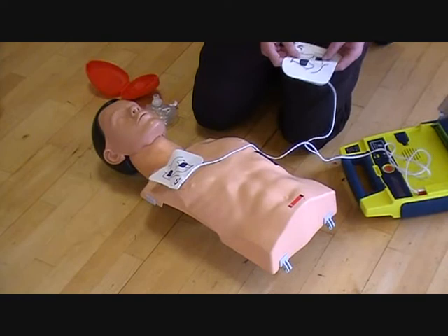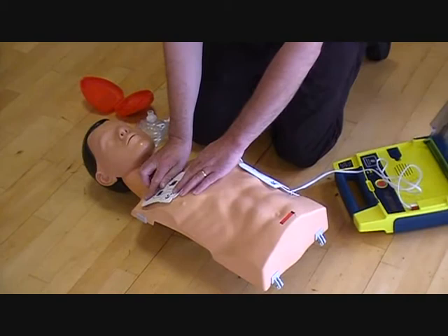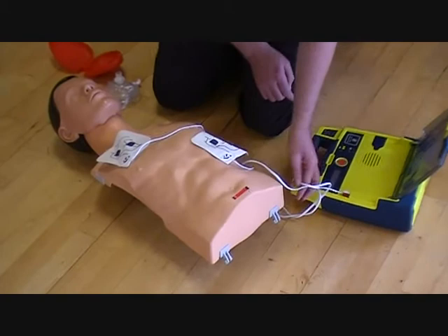Peel one pad, front plastic liner. Place one pad on bare upper chest. Peel second pad, do not touch patient.